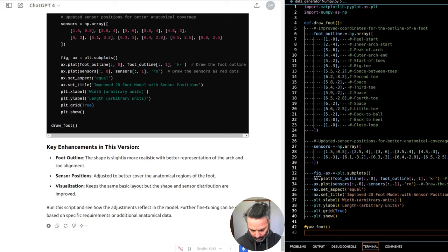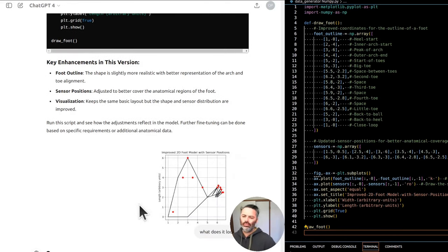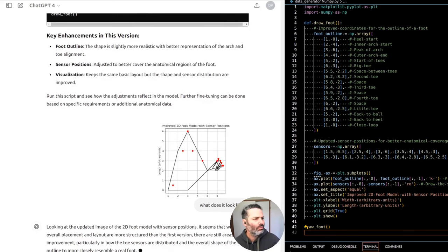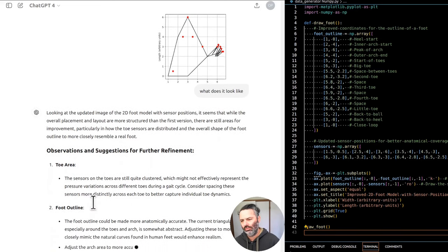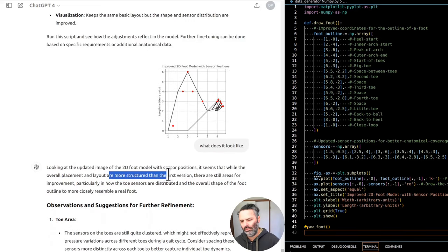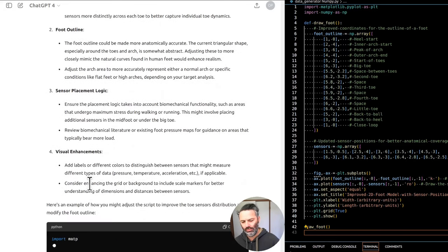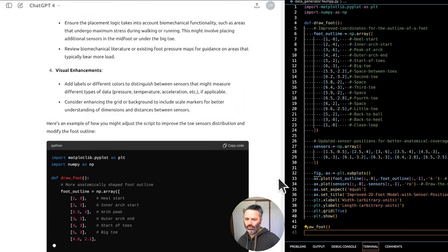Looking at the image you provided of the 2D foot model, there are a few improvements we can make to the code to better align the sensor placements and enhance the overall model visualization. Here are some specific adjustments. 1. Refine the foot outline. The current outline is very basic and doesn't closely resemble the anatomical structure of a foot. We can modify this to better represent the arch, heel, and toes. 2. Adjust sensor positions. The sensors on the toes need better alignment, and additional sensors might be needed in areas like the heel and midfoot for better coverage.